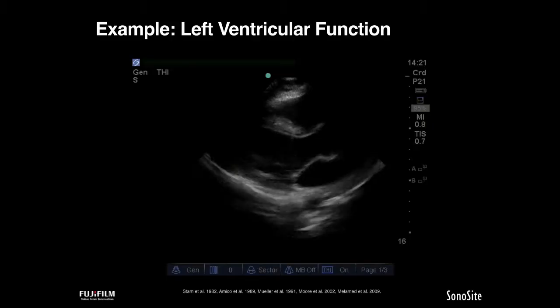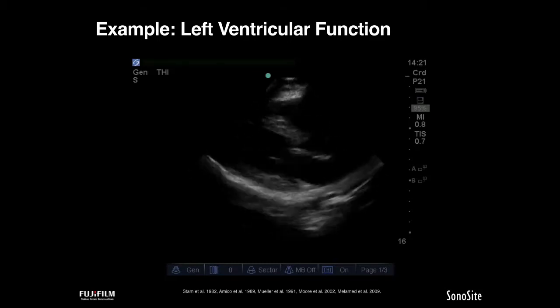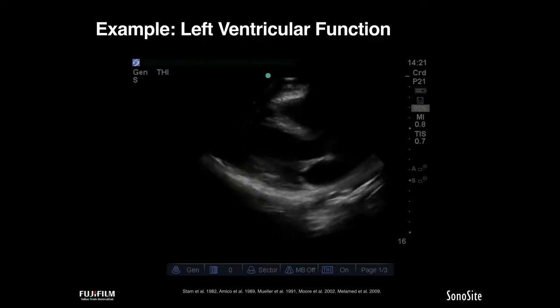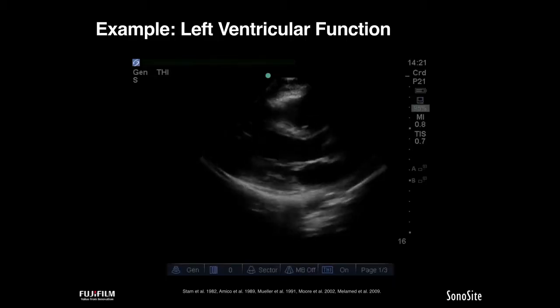So when you look at this ventricle in the parasternal long axis, whether you know how you're doing it, which I'll talk about in a moment, or you're just doing it with a gestalt, your impression, after very little training, will accurately tell you that this ventricle is not one that is a complicating or culprit left ventricle capable of causing critical illness. And this is the eyeball method at its essence.